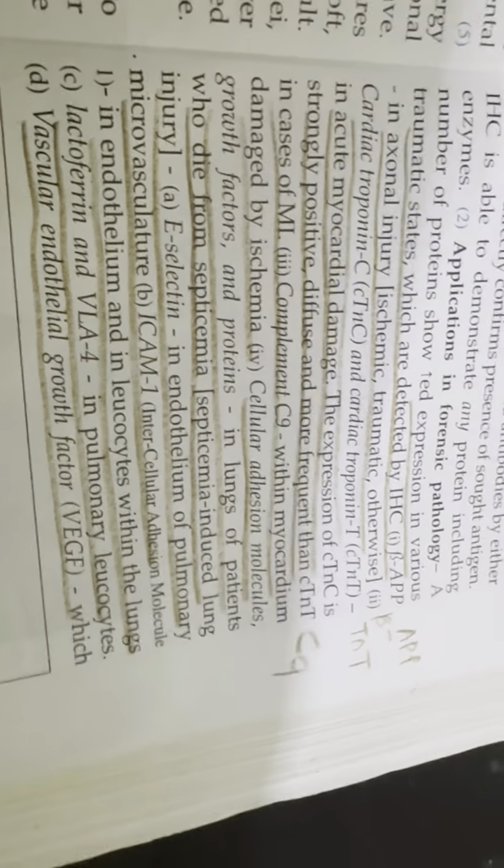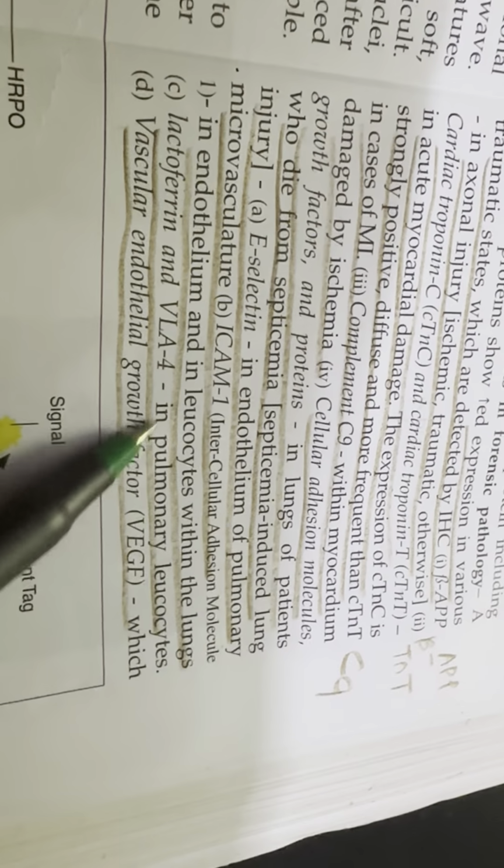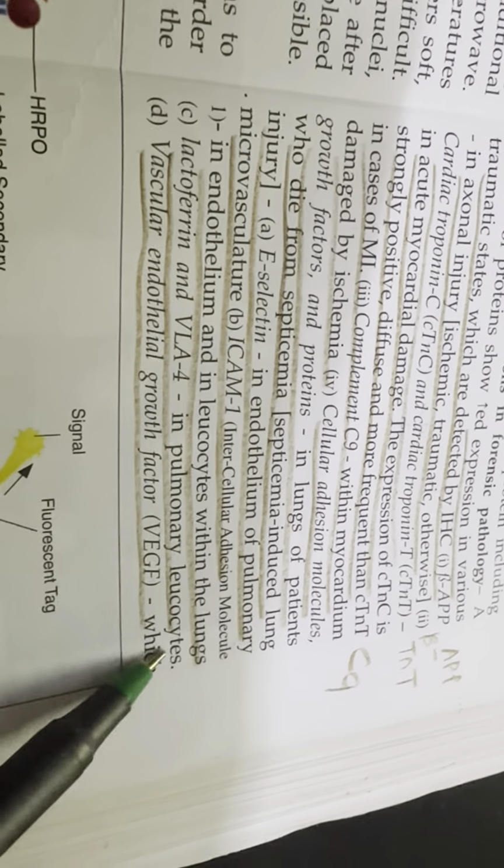E-selectin in endothelium of pulmonary vasculature. ICAM, intercellular adhesion molecule, in endothelium and in leukocytes within the lungs. Lactoferrin and VLA-4 in pulmonary leukocytes.